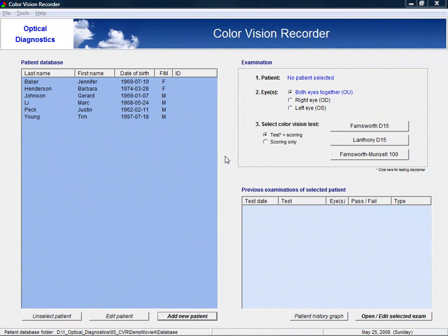Here you see the main window of the color vision recorder. On the left you find the patient database. You can simply add a patient by clicking on the Add New Patient button.